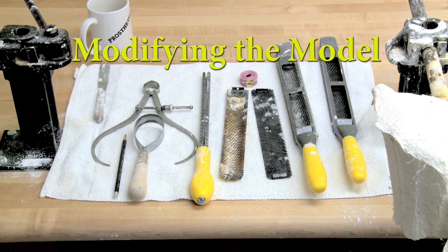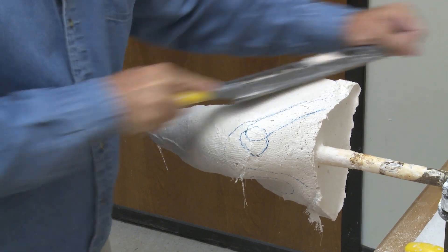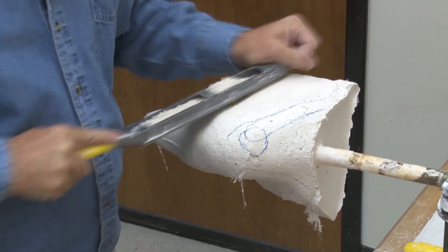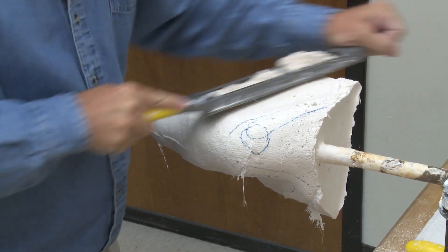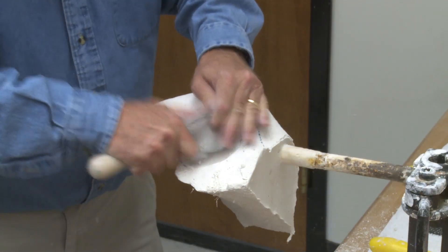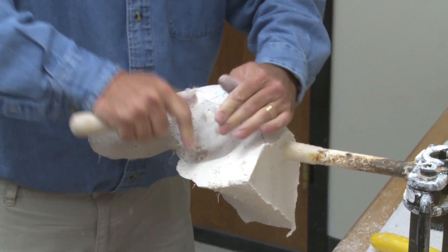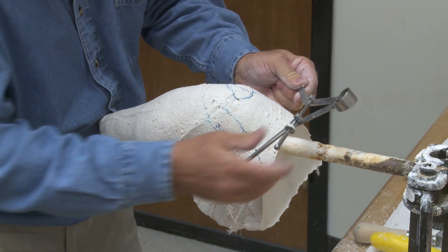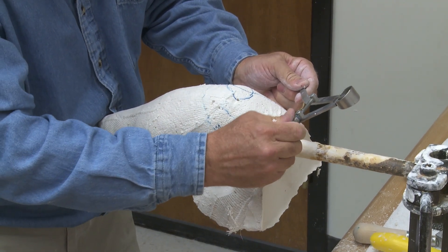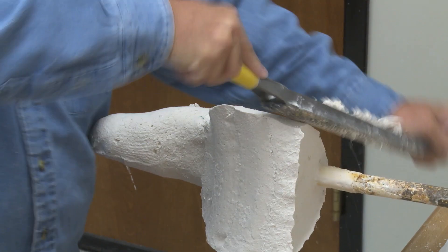Standard tools are used for modifying the positive model. Begin by removing material posterior in the area of the scapula, doing this at the same angle as the spine of the scapula, both from lateral to medial and superior to inferior. Next, remove material anterior at the head of the humerus. These two modifications will determine the AP dimension of the socket. For a patient with a large amount of soft tissue, more material can be removed. For the more bony patient, care must be taken not to impinge on the bony anatomy.